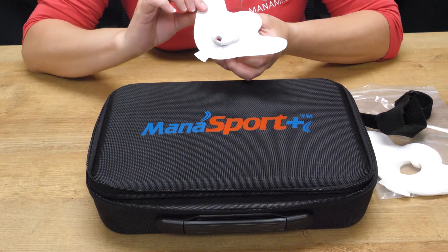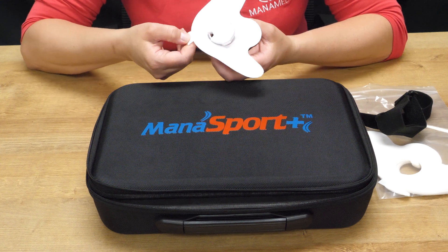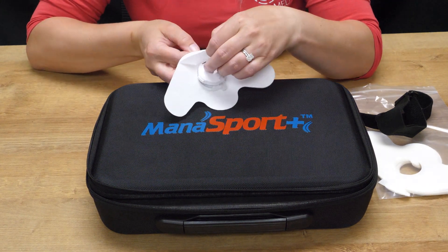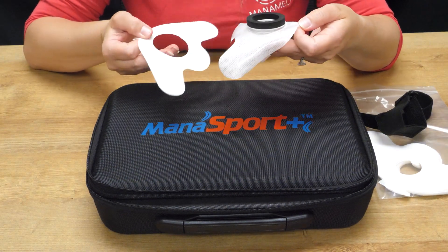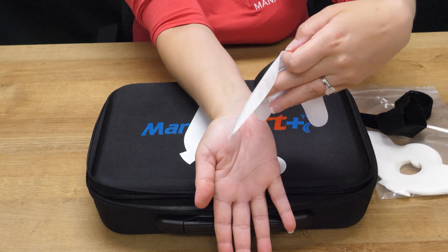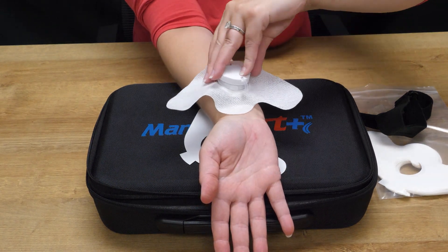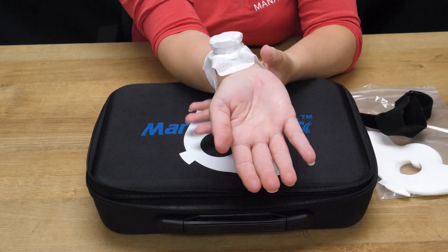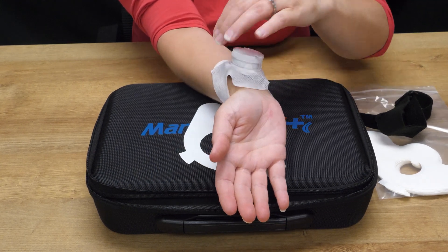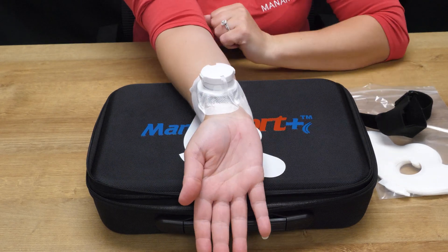The components remain the same — the difference will just be this. When you're ready, hold it by the top and pull it off. You'll want it straight down on the body part; gently press it down on your skin and you're ready for treatment.